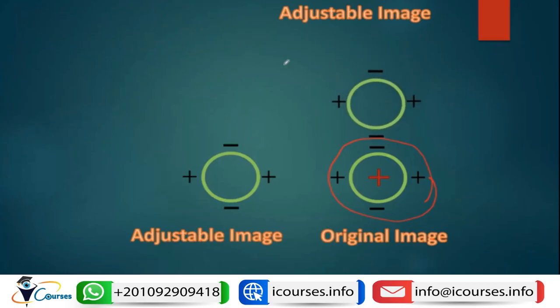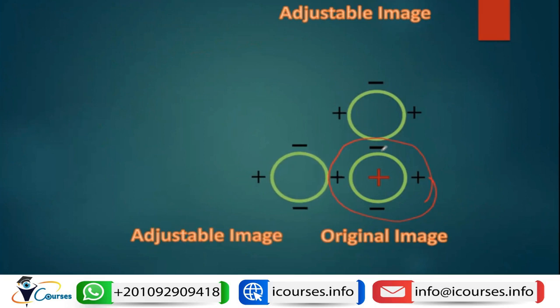By approximation of the vertical one, so that the minus sign overlaps the minus sign, and approximation of the horizontal one so that the plus sign overlaps the plus sign, we now reach the correct image size. So the object size is fixed, but the image size is adjustable by just moving the mirrors until they coincide with the plus and the minus signs of the original image. And that's how we can reach the correct image size, and we now can read the number on the scale of the keratometer, so we know the keratometric reading, and we know the radius of curvature.